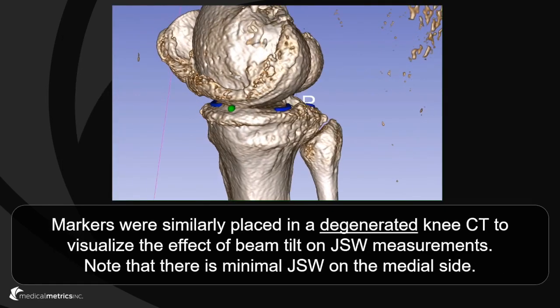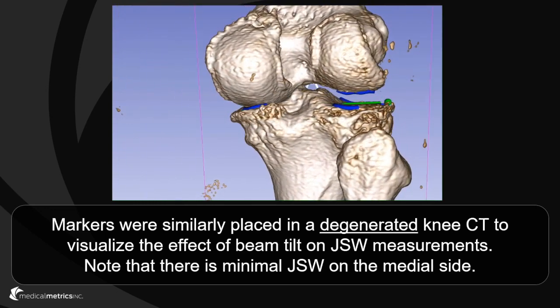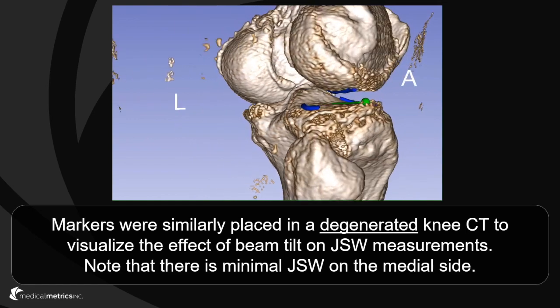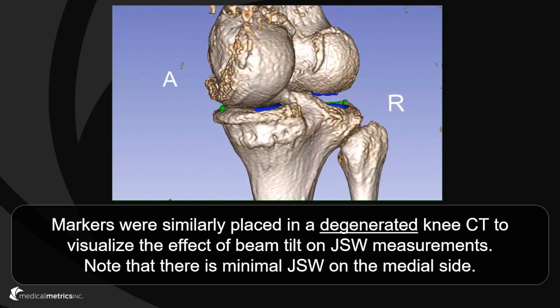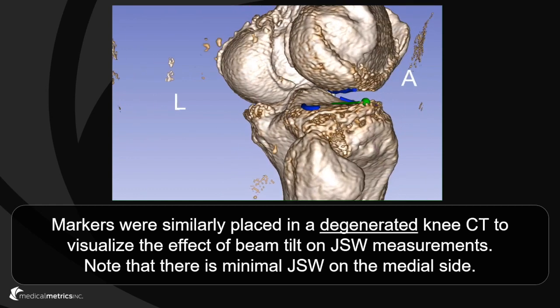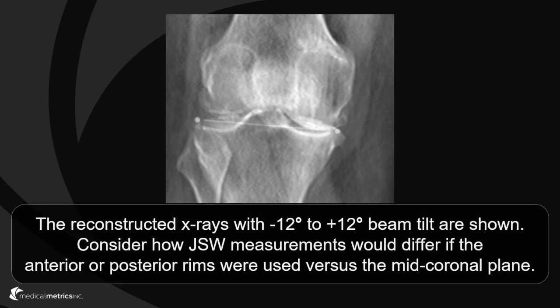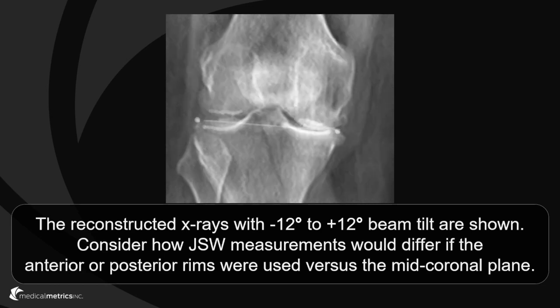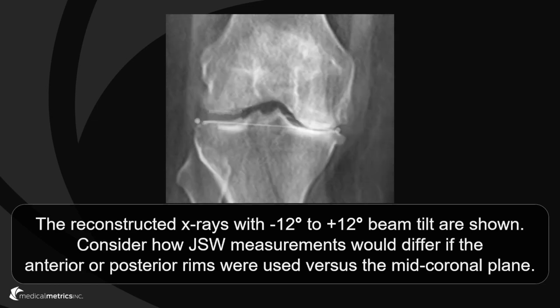Markers were similarly placed in a CT exam of a degenerated knee to visualize the effect of beam tilt on joint space width measurements. Note that there is minimal joint space width on the medial side. Digitally reconstructed radiographs with between minus 12 and plus 12 degrees of beam tilt are shown. Consider how joint space width measurements would differ if the most prominent radiographic shadow was used versus the mid-coronal plane method.